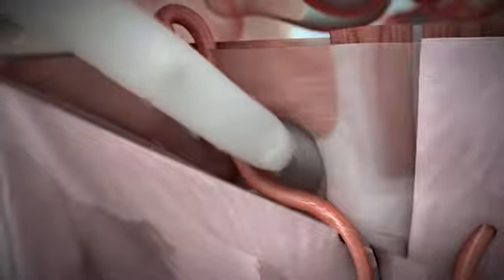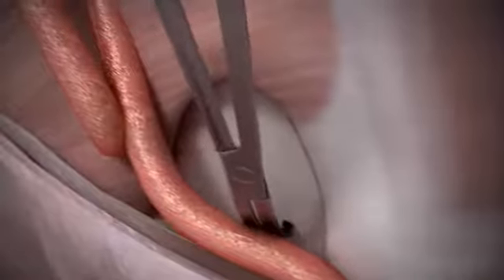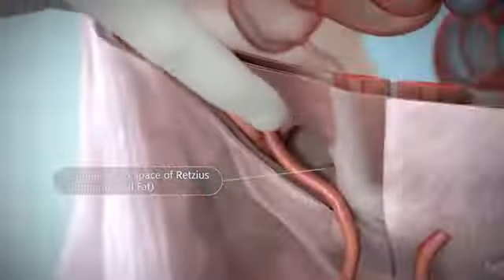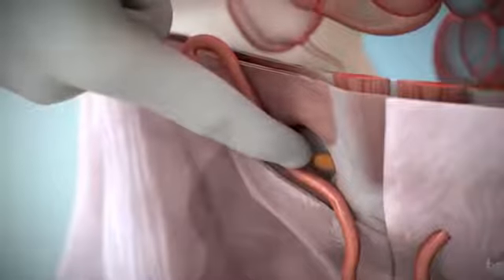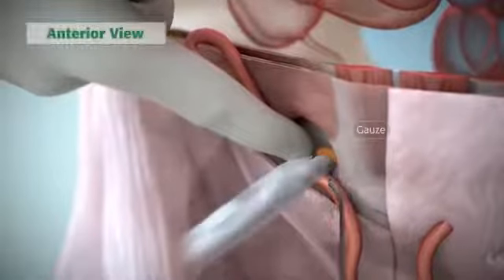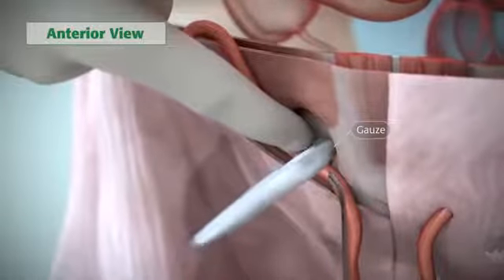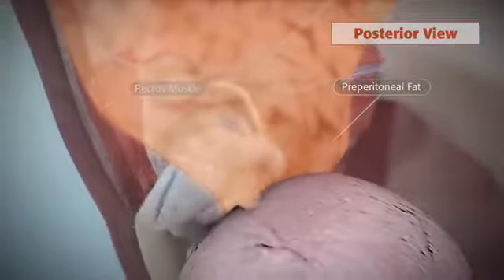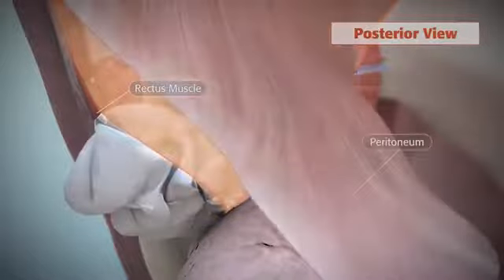This can be done by either digitally dissecting through the fascia or with the use of an appropriate surgical instrument to gently spread the fibers before digitally penetrating through the transversalis fascia. Using blunt forceps, guide a large 20 by 20 cm moist sterile gauze down the index finger into the space of Retzius. No digital dissection of the preperitoneal space or space of Retzius is performed during the Onstep technique.